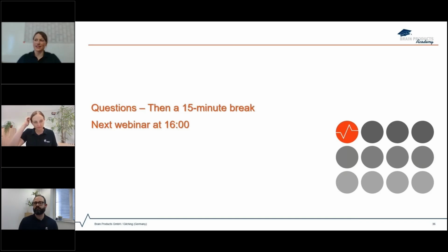Yeah, that's a great question. So I think removing vibration-related artifacts that are specifically induced by the MRI is quite difficult by using analysis methods, because we tend to see that these vibration artifacts are not concentrated in one specific frequency domain. So you can't just apply a bandpass filter, for example. Rather, they tend to be spread across the frequency domain.